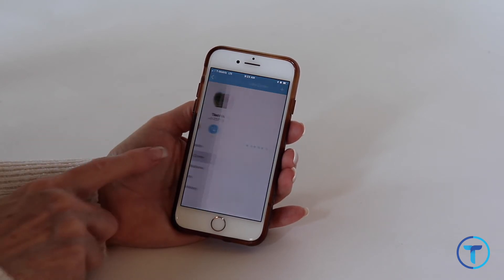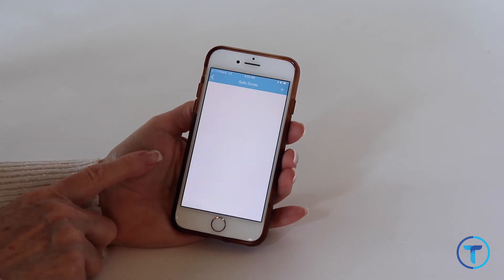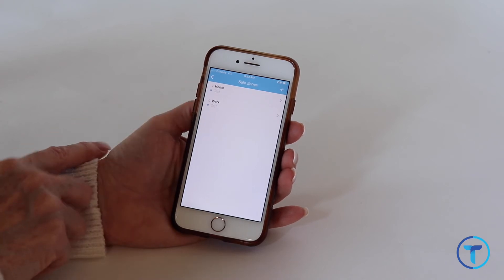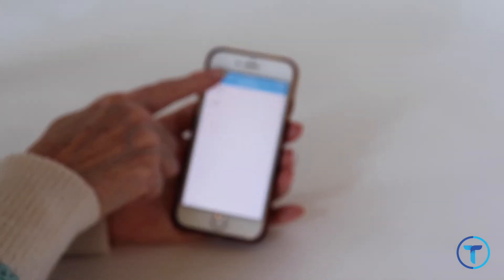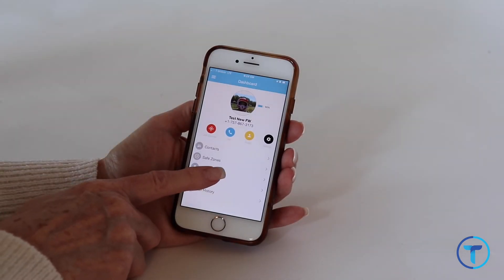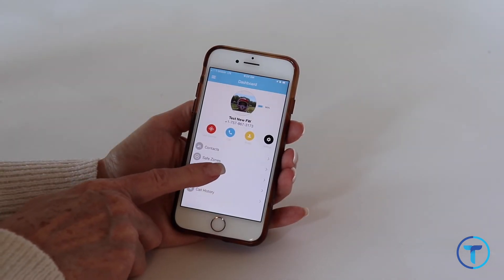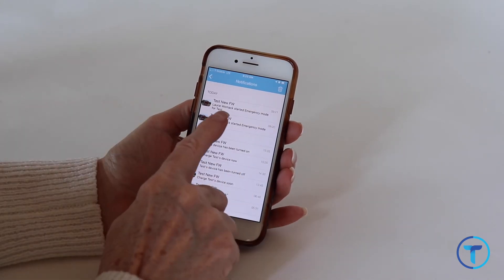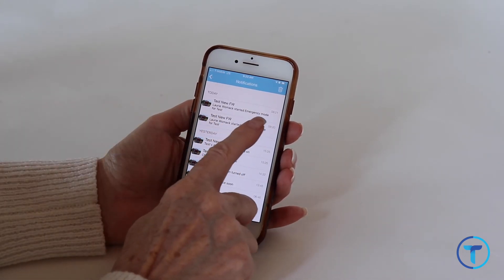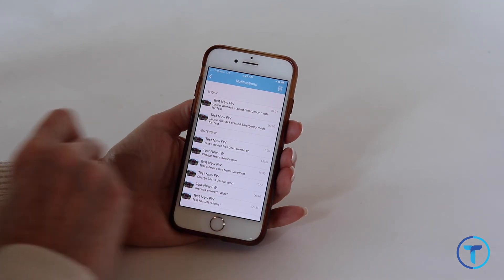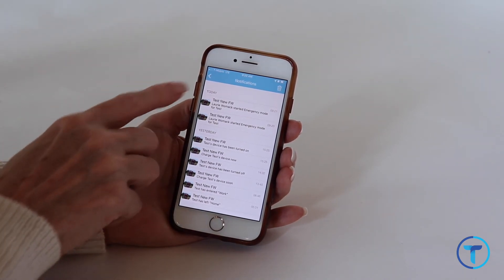Safe zones — this is a way to see how many safe zones you have, and the top right plus sign is where you can add safe zones to the list. There isn't a limit to the number of safe zones you can have. Notifications shows the history of all the banner alerts you may have missed. Know that any guest users you may have can see these notifications as well.